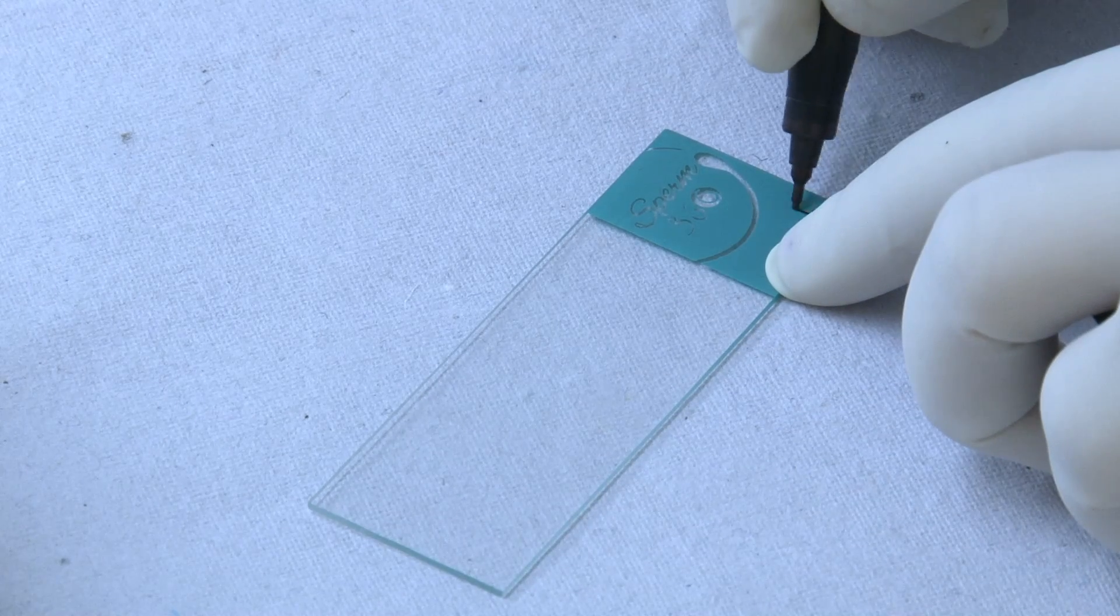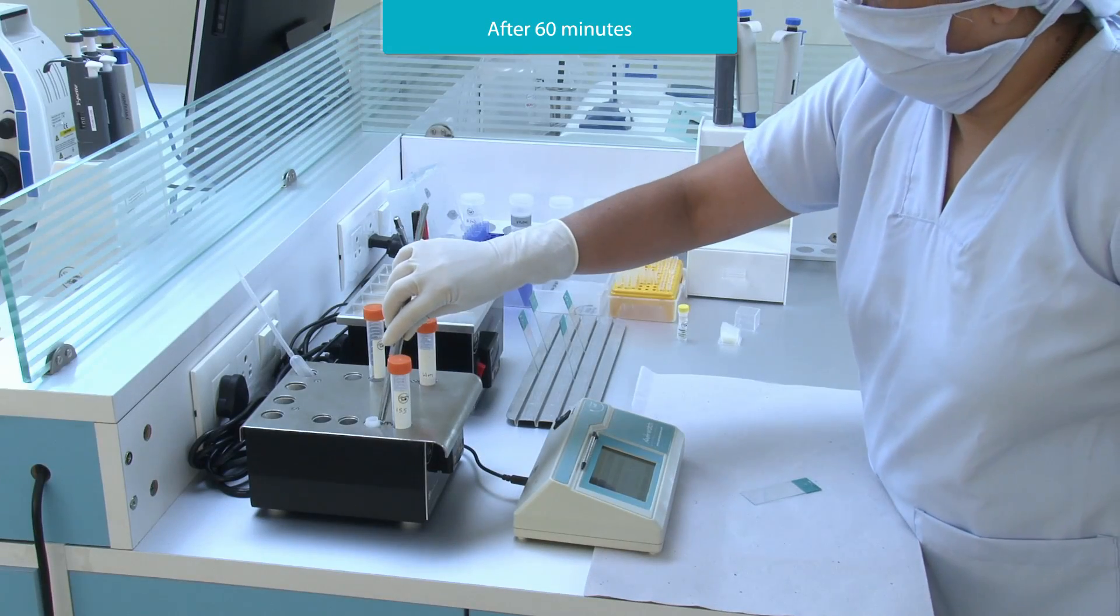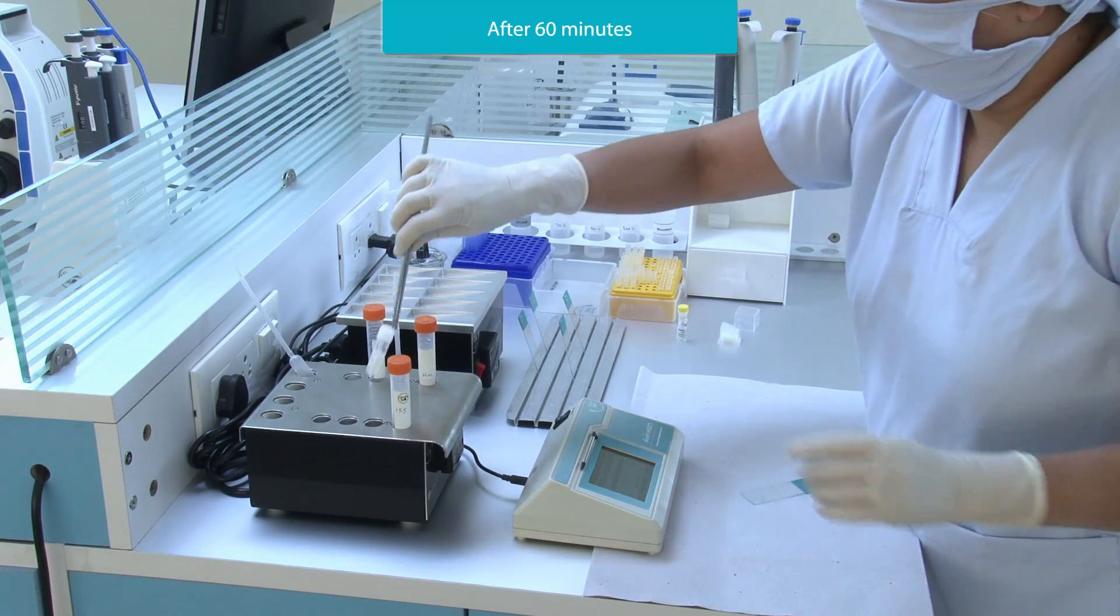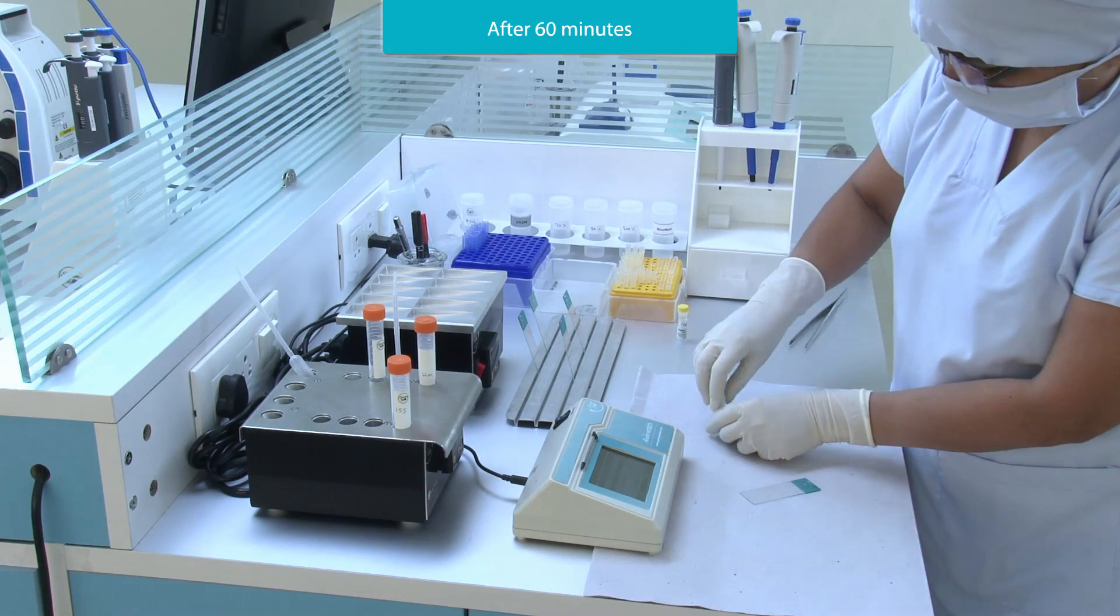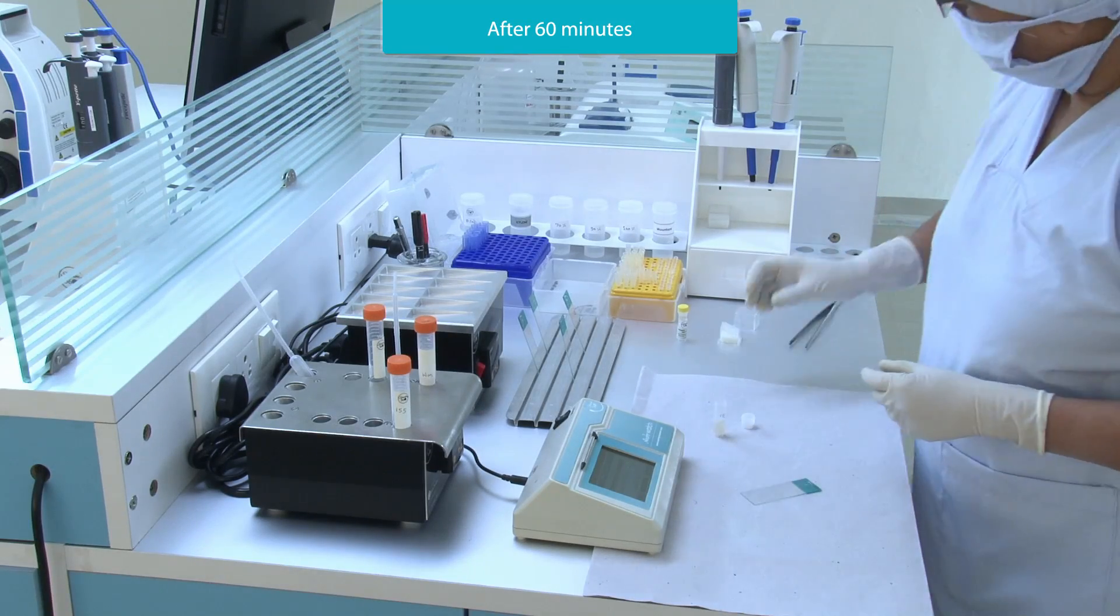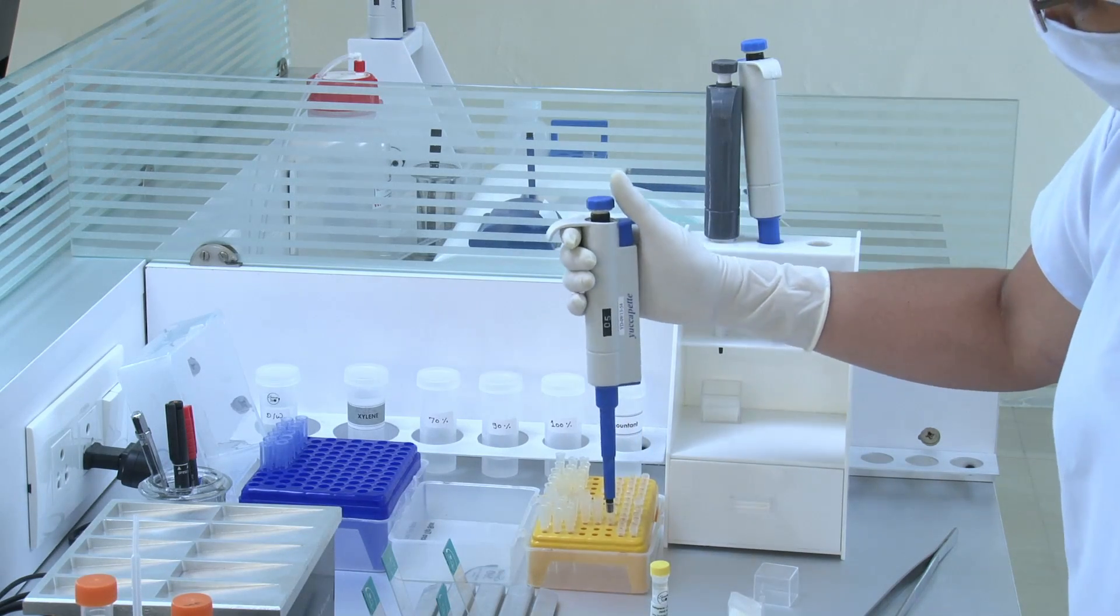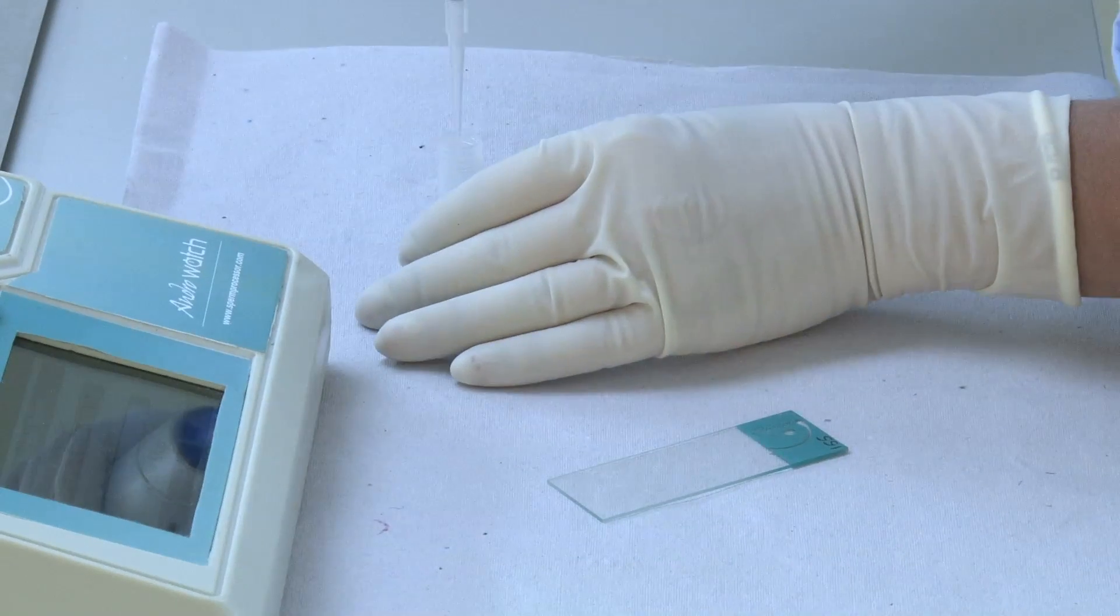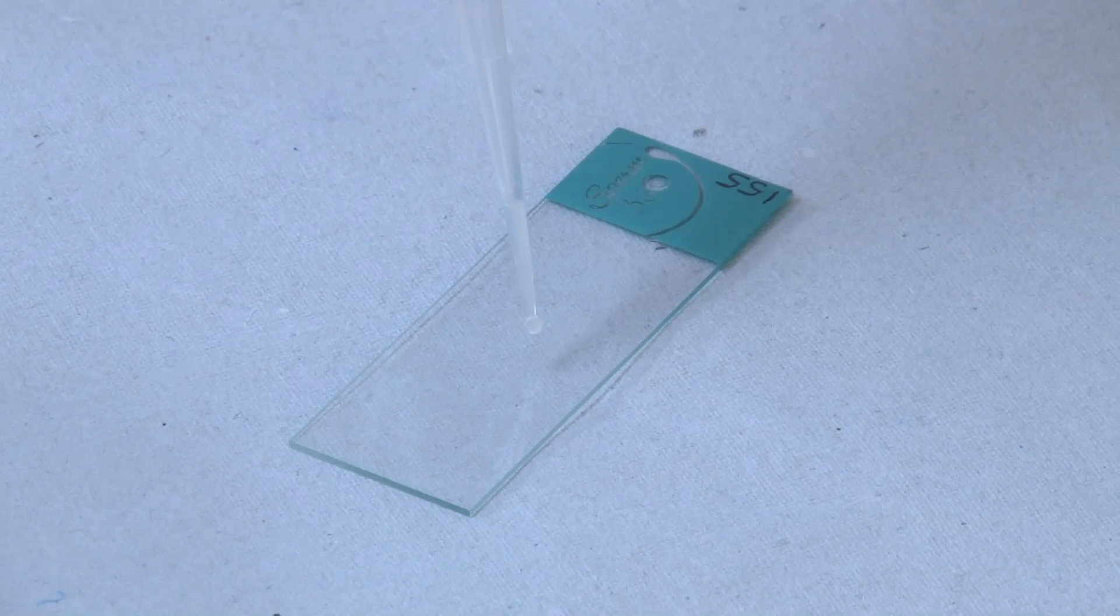Take a slide and label it with ID. Place 5 microliters of incubated semen on the slide.